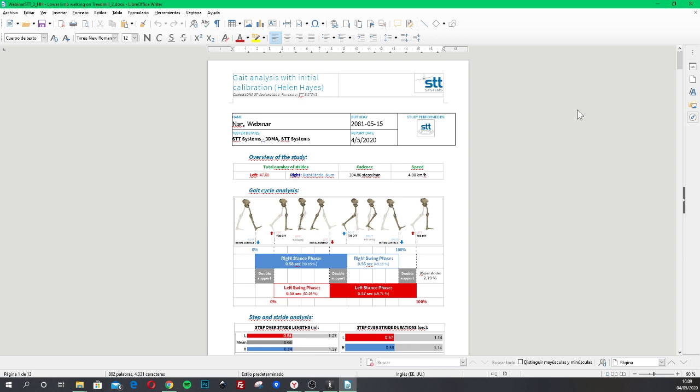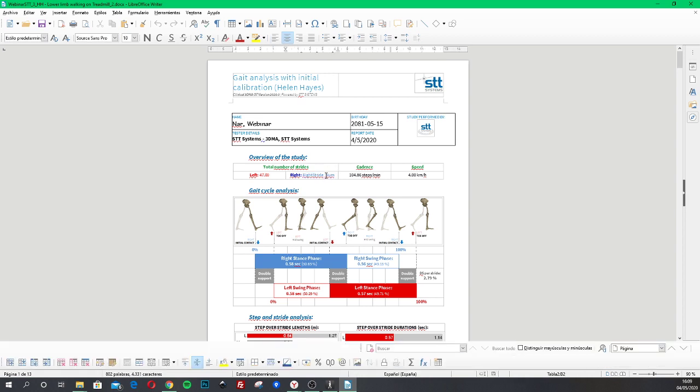Okay, and here we have the customized report. Of course our customization is quite simple. We did some changes on the colors, on the font type, nothing but that. But we can see how it's affected and how it works. Remember not to edit the labels. We can change the style, but not the number, not the label, not the text of the label. Otherwise, it will happen as this. We get the label instead of the number.